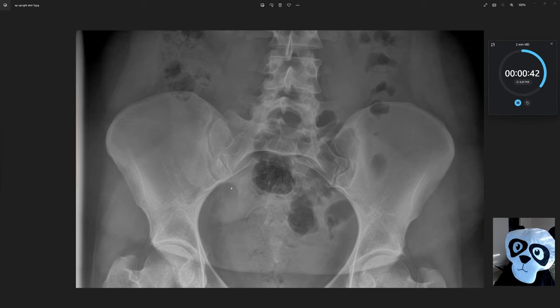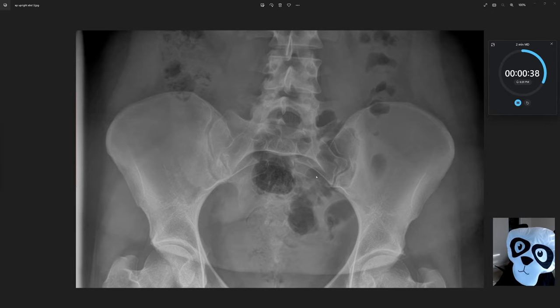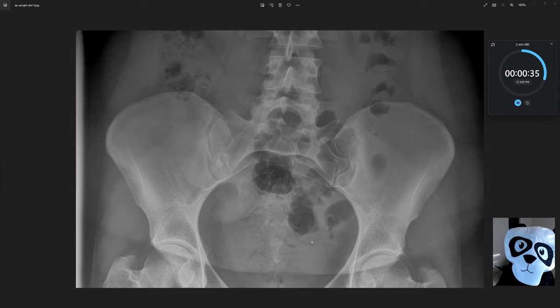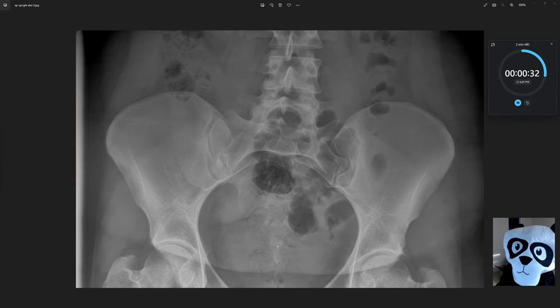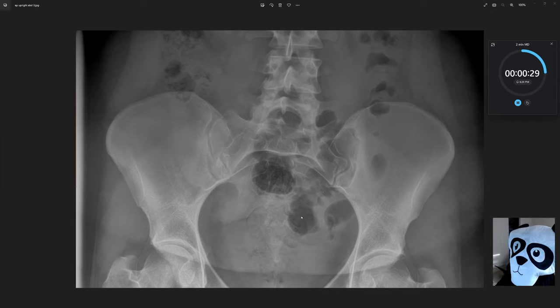Within the pelvis and the lower abdomen, we don't see any abnormal calcifications, so there's no concern for renal calculi. The sacrum is partially obscured by overlying bowel gas, which is not abnormal.